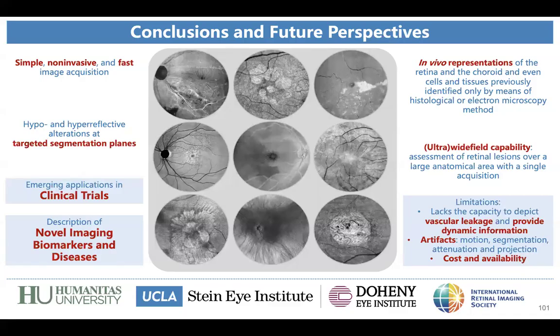Ultra-widefield images can add a piece to the puzzle when we are looking for the diagnosis, the best care or biomarkers. But as with any other imaging modality in the retina, it won't be the standalone technique.